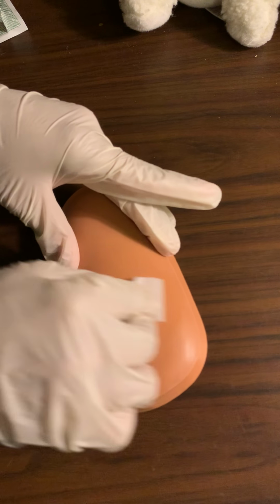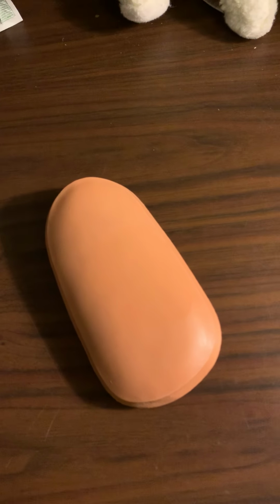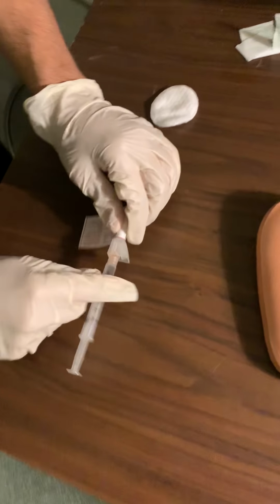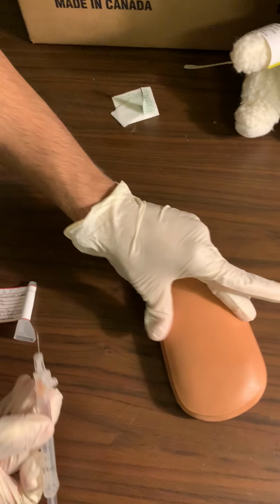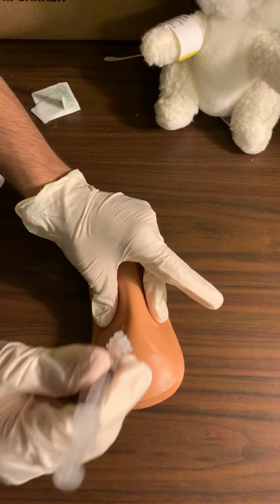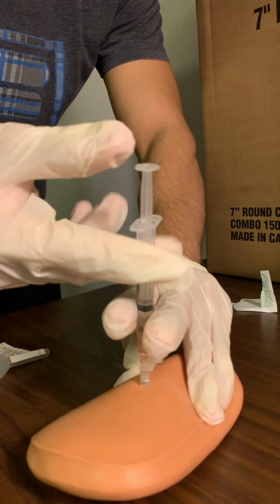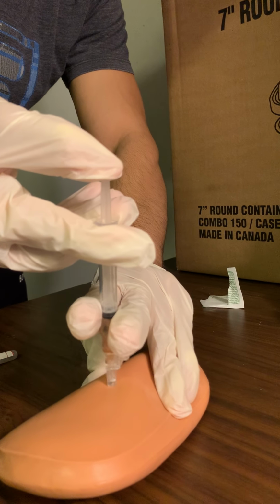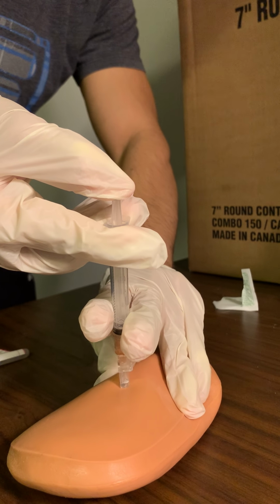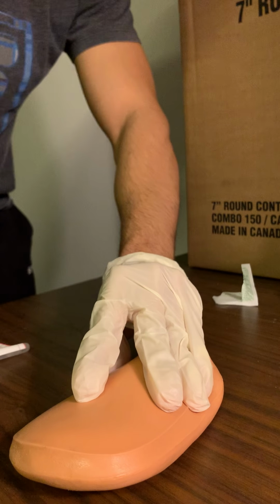Okay, we can just say that's been 30 seconds right now. But I would continue for 30 seconds. Okay, now I'm just going to uncap my needle. Okay, I'm going to be bunching the skin. My patient has a lot of subcutaneous fat, so I can go down on a 90 degree angle. Okay, and now I can stabilize. Inject slowly. Unstabilize. And then take it out.